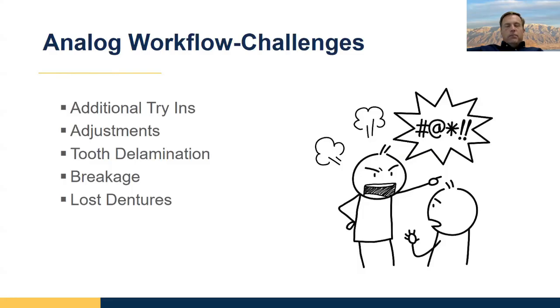Breakage. Again, if we make our dentures thick enough, they should be fairly resistant to breakage, but if they get dropped on the floor, that's not going to help very much. And the other thing is that there are some patients who can overload our dentures. One of the nice things about printed dentures is that some of the latest materials are actually a little bit stronger than the processed materials, as we'll talk about. So that gives you a better option, something sturdier for your patients.